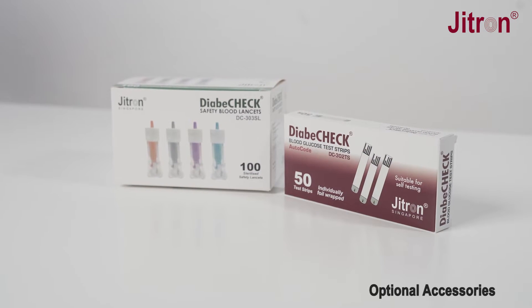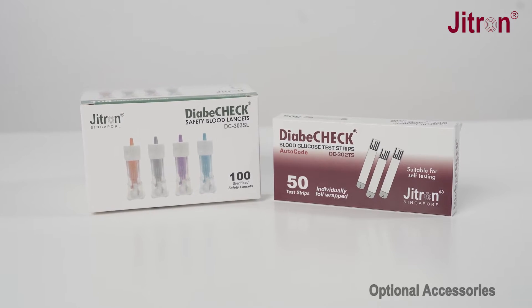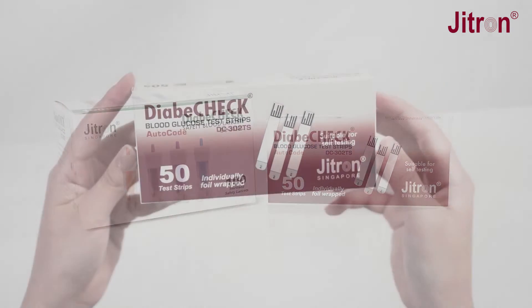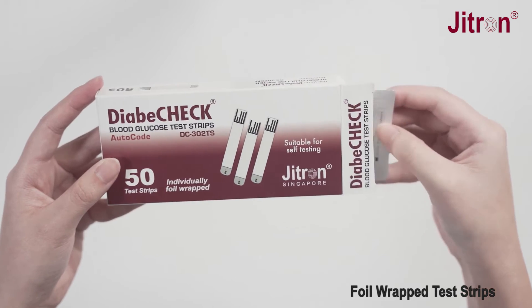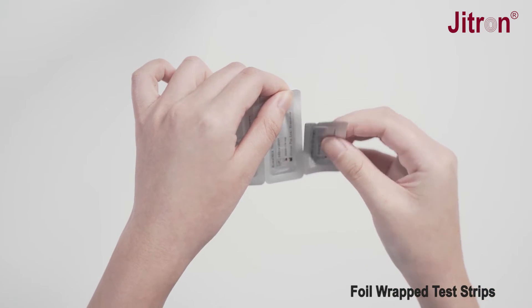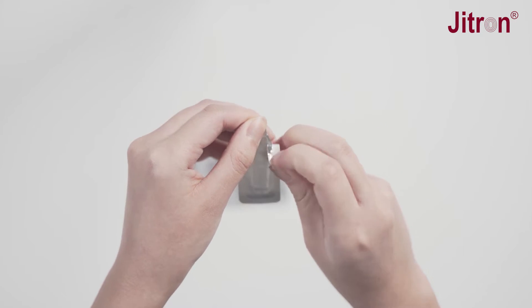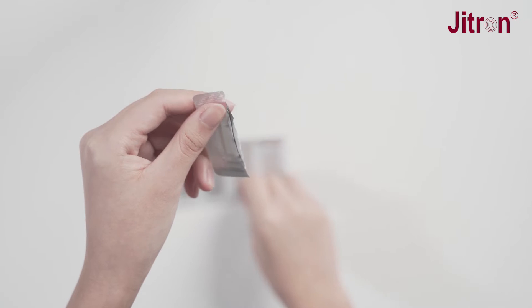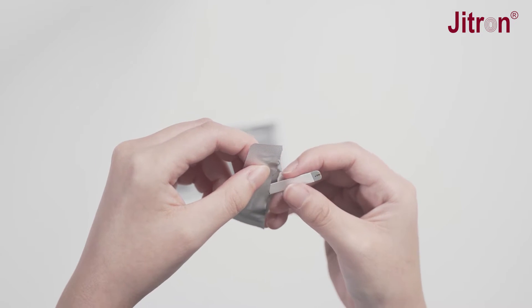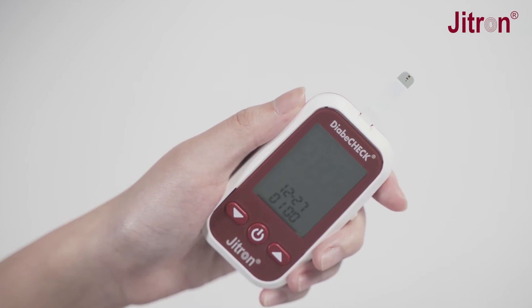We have the following optional accessories for individual and hospital use. The Diabicheck individually foil-wrapped test strips DC302TS are long-lasting and convenient to use. They reduce the risk of bacterial cross-contamination and wastage while using the blood glucose monitoring system.